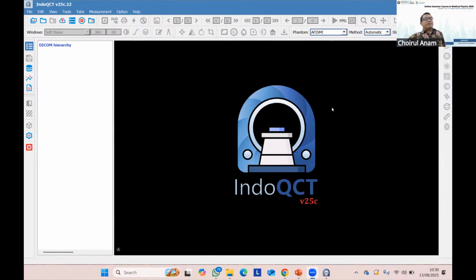But because the file is relatively large, around 100 megabyte, maybe it takes time, and sometimes in the downloading process, something happens. So you can try again. And it is important to note that maybe your computer detects the IndoQCT as a virus. So please keep in mind, if you download the IndoQCT, turn off the antivirus. You can try again.